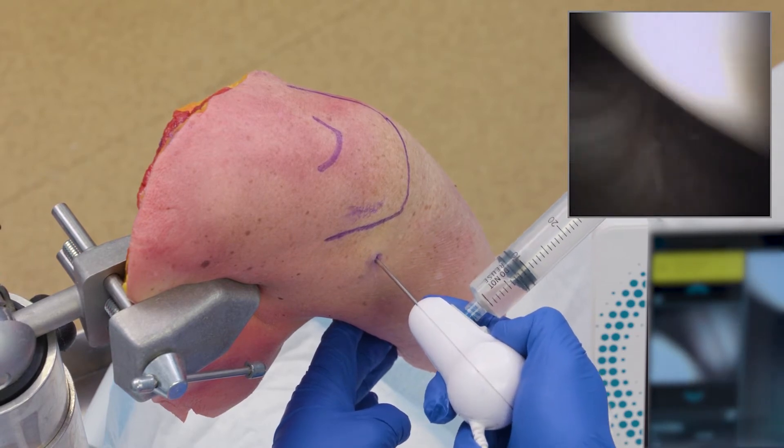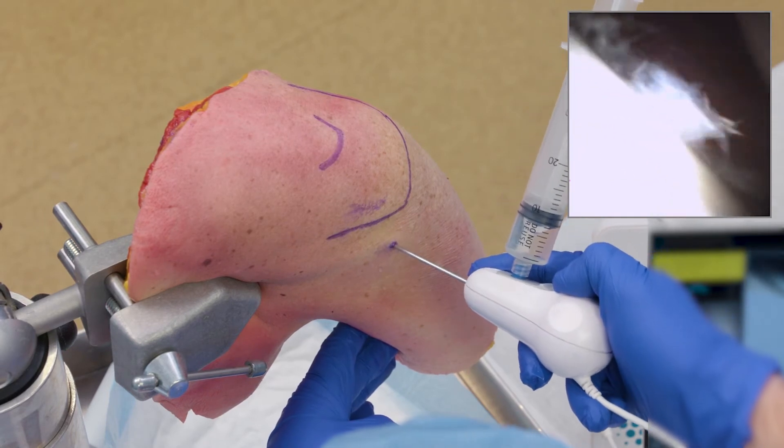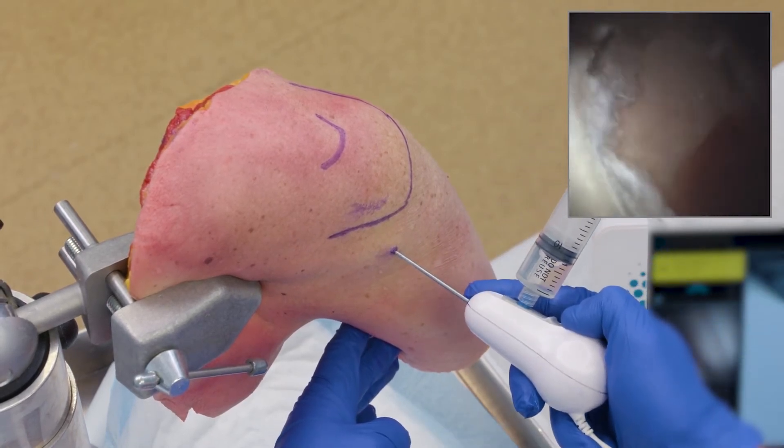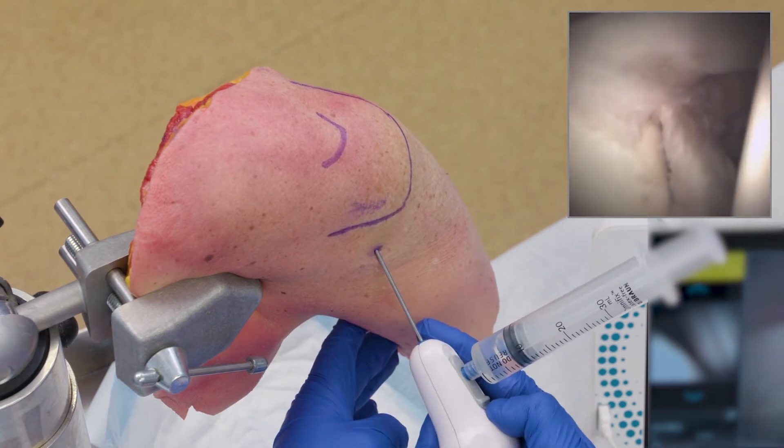From here I can pull back my hand, look at my posterior labrum as I come up the back of the glenoid, and get back to my superior labrum where my biceps attaches.